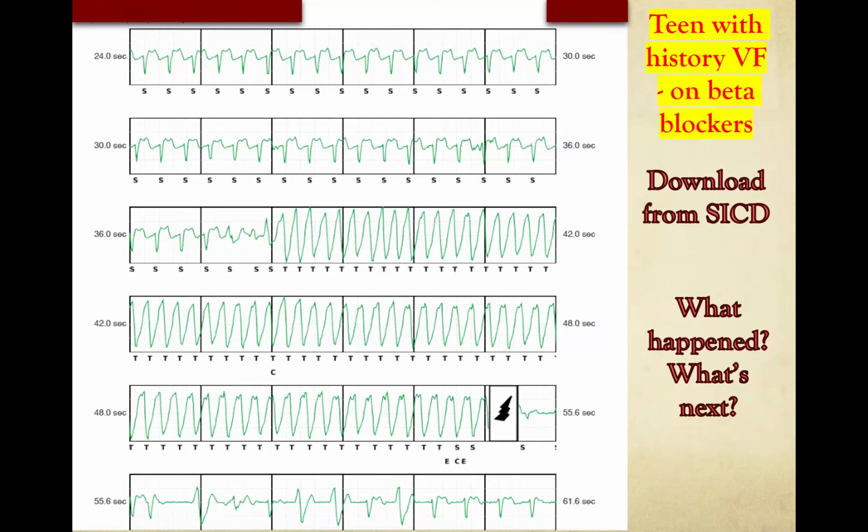I used to work with a surgeon who would put the transvenous lead in and then tunnel it to the abdomen and place the device under the rectus sheath. It's a very nice cosmetic result because the patient would have no bulge, and it worked fairly well. But as you would imagine, extraction one day could be a real disaster, a major undertaking.